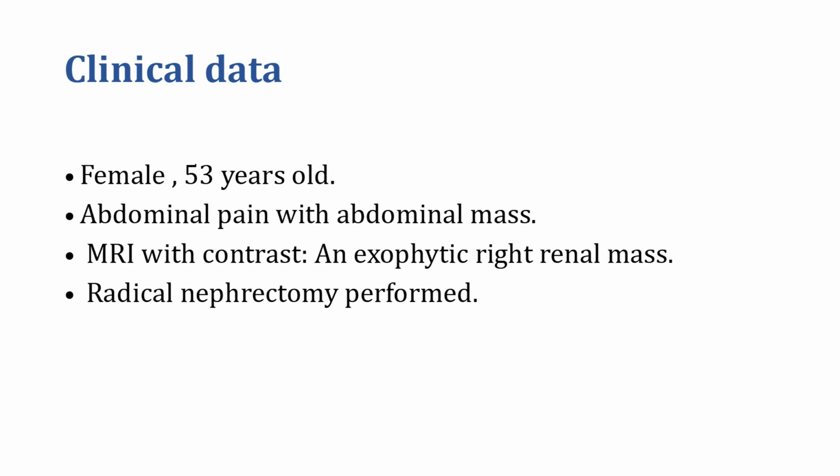Our case is a female patient, 53 years old, presented with abdominal pain and abdominal mass. MRI with contrast showed an exophytic right renal mass. The patient underwent radical nephrectomy and the specimen was sent to our lab.